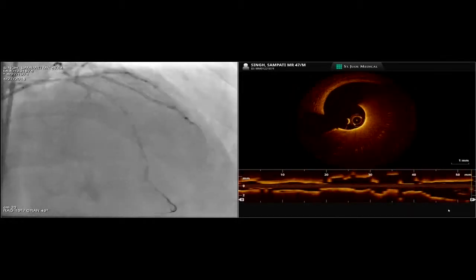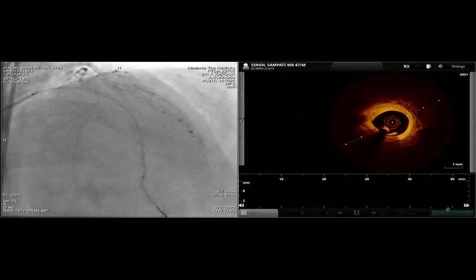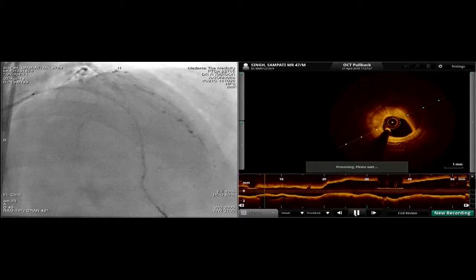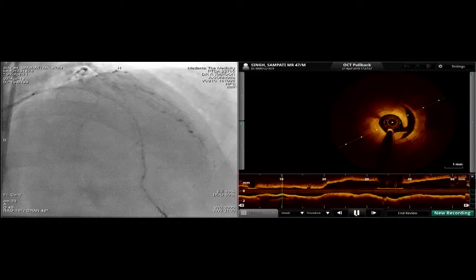Yeah, okay. Now show us the left main lesion. I think that's the major question. It was LAD lesion, we know we have to stent it, so the additional information which OCT gives us is the size of the vessel and the length, but the key question is, how does the left main lesion look like on OCT?